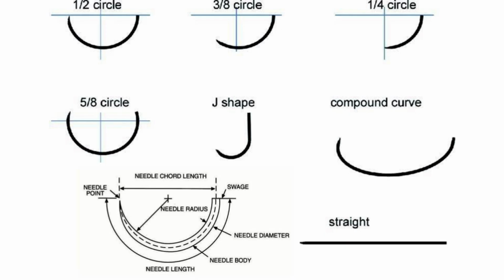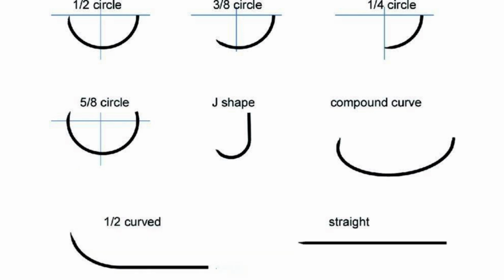The body is the most substantial part of the needle and connects the eye to the point and determines the shape of the needle. The needle can be straight or curved, which is more common. Due to the risk of needle stick injuries, straight needles are rarely used.